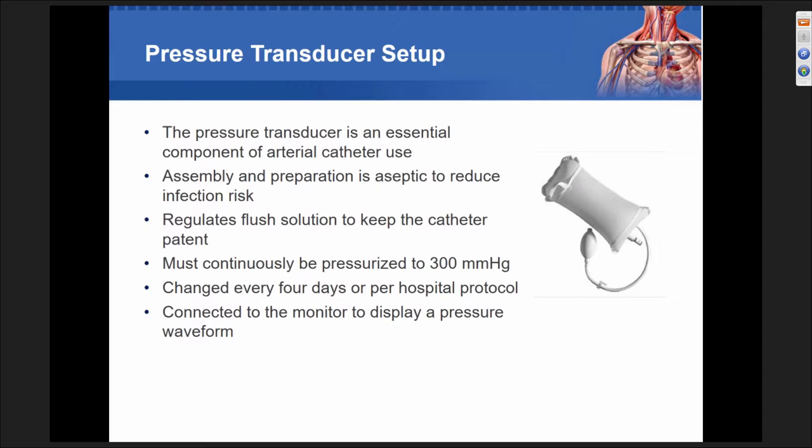Assembly and preparation of this setup is in an aseptic manner because this setup actually attaches to the patient during the sterile procedure and dwells for 4 days. And if there's risk of contamination or infection at the catheter connection, then that goes right up the catheter body into the bloodstream. And that would be a catheter-related bloodstream infection related to an add-on component. So very, very important. So I'm going to ask you again, who's making your transducer setup?